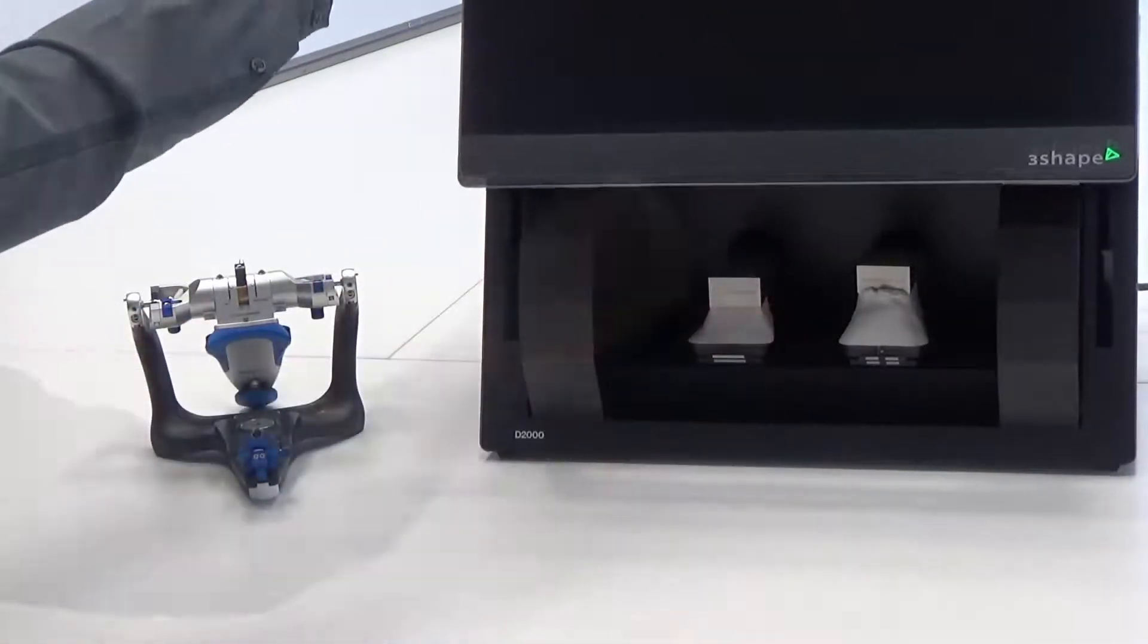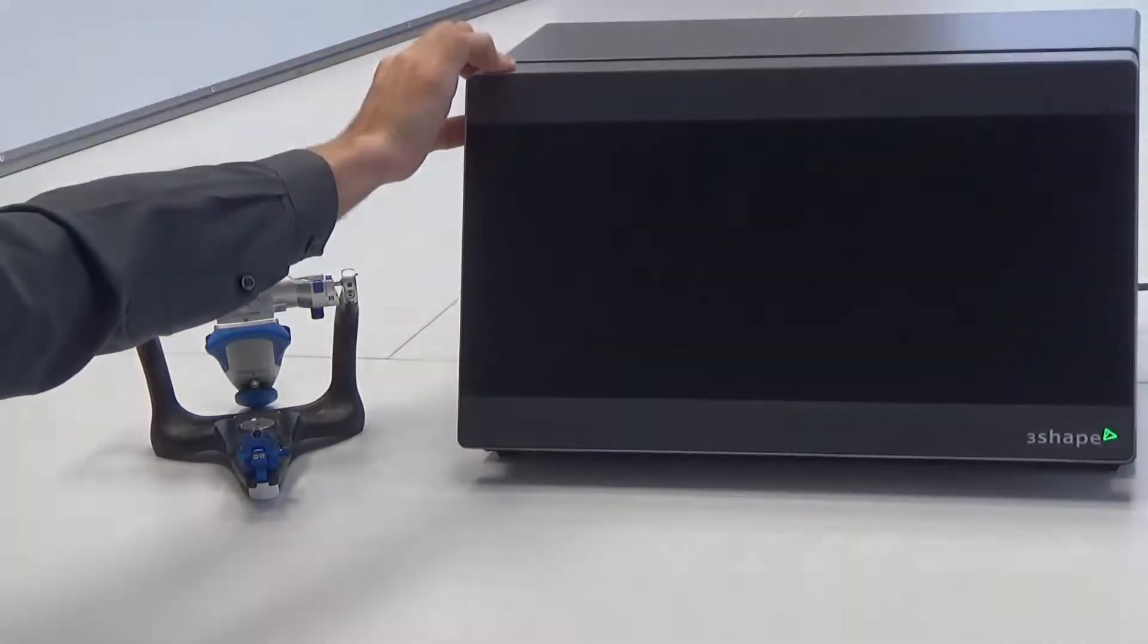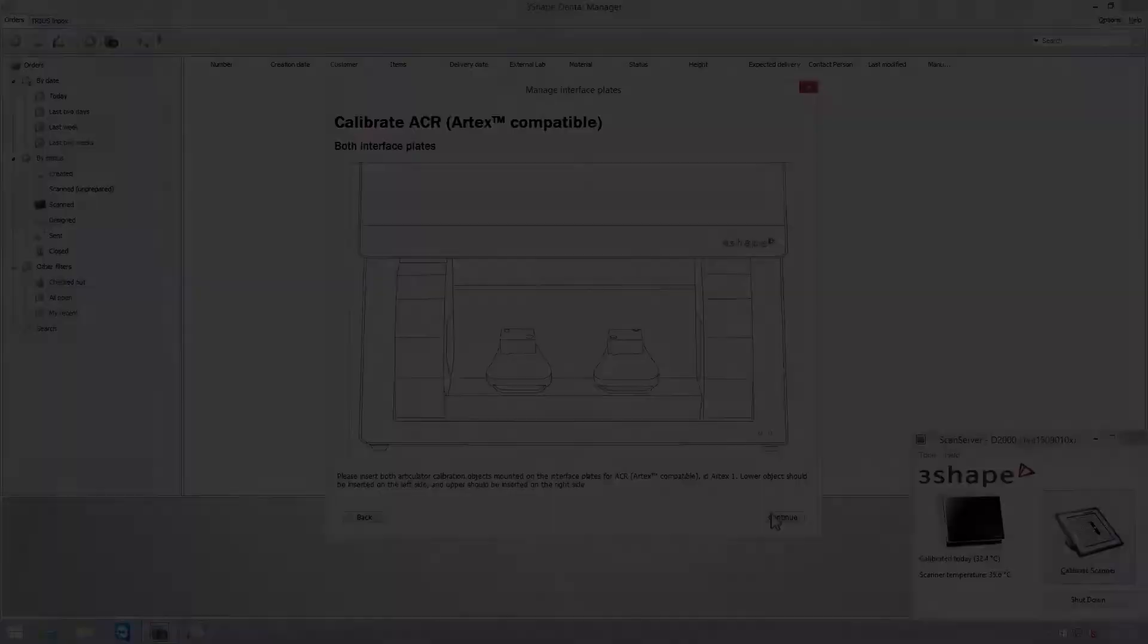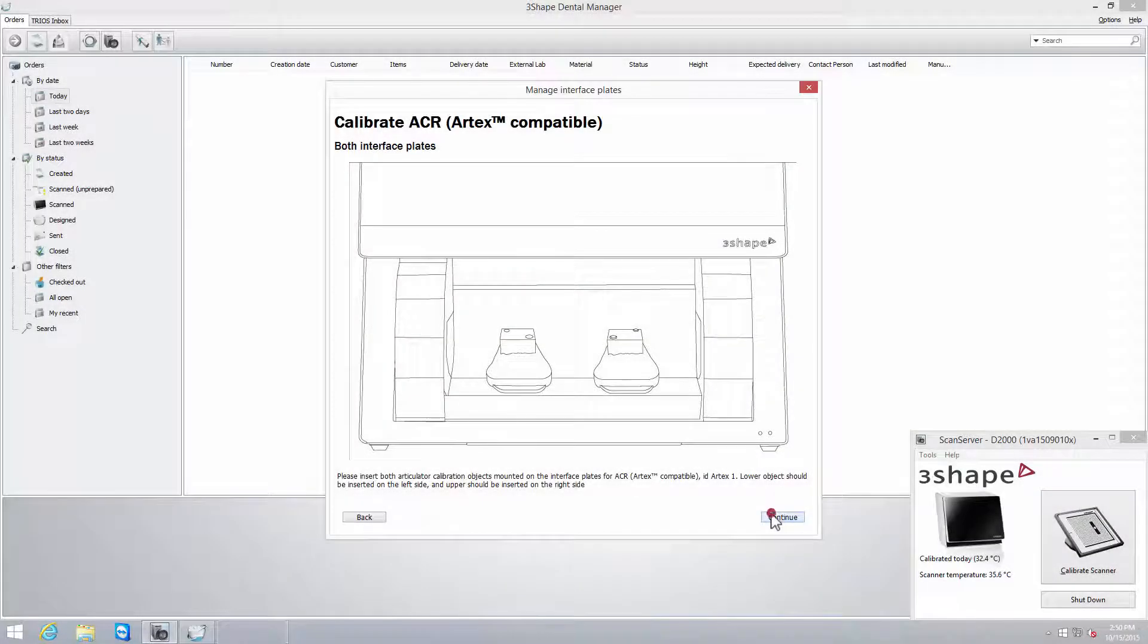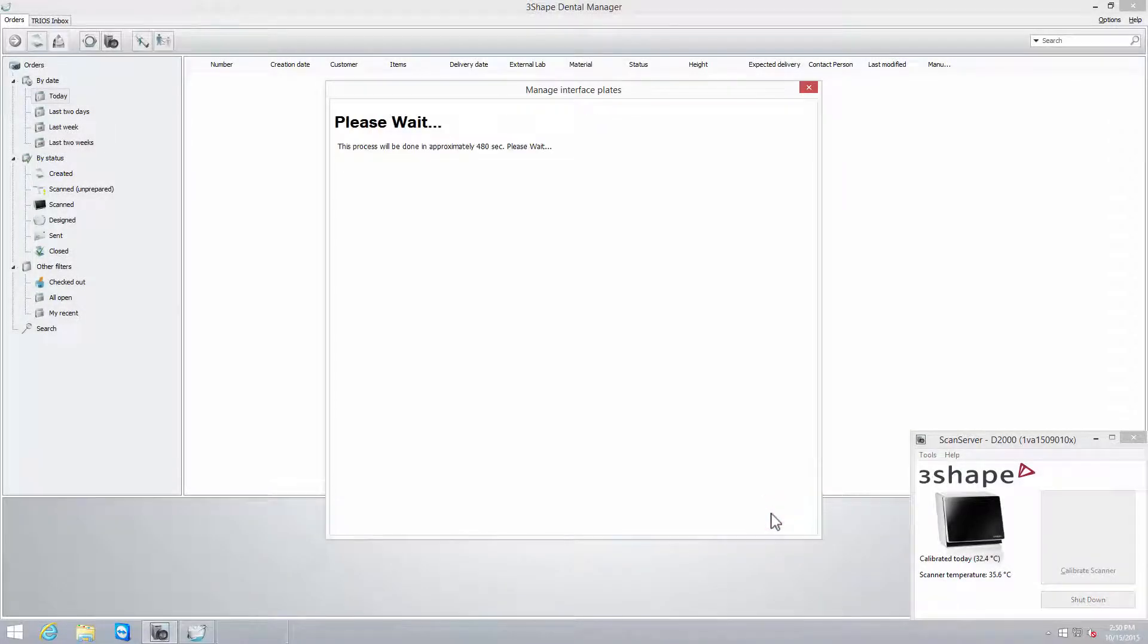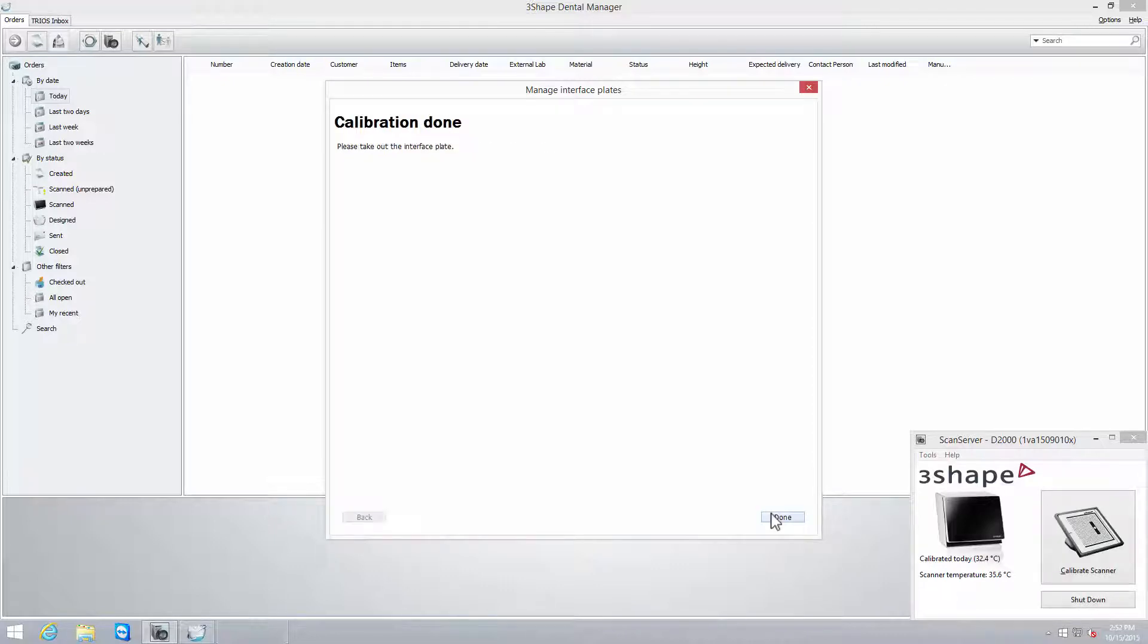Close the scanner, and click Continue to start calibration. If you use a scanner other than the D2000, you will have to do that process separately for the lower and the upper part.